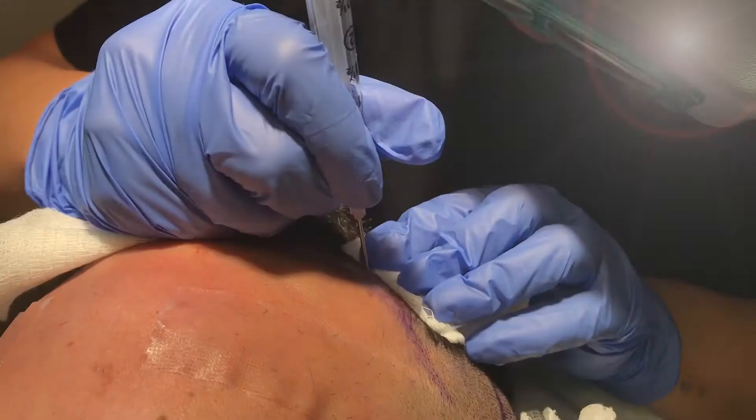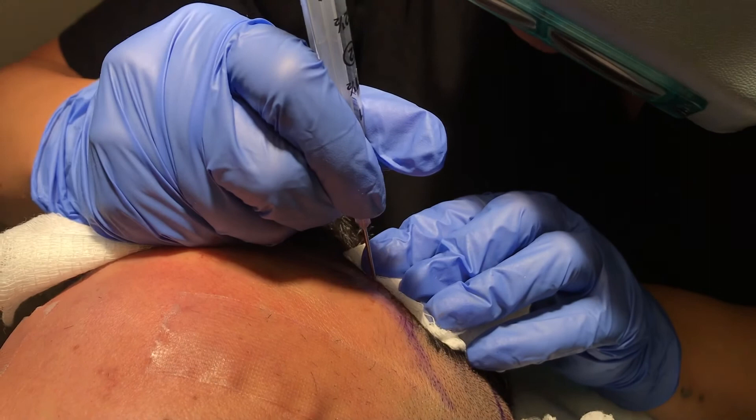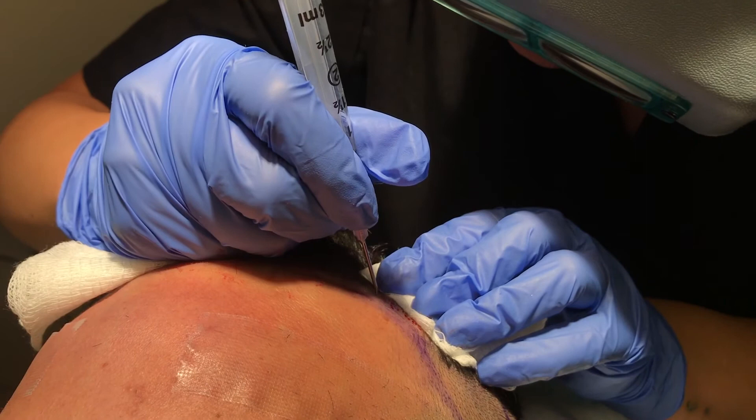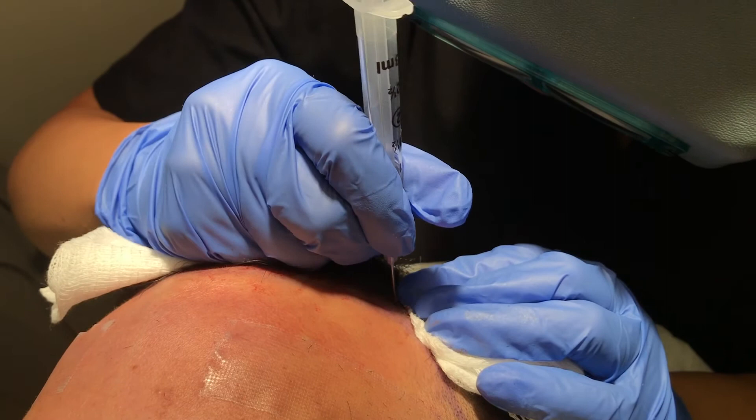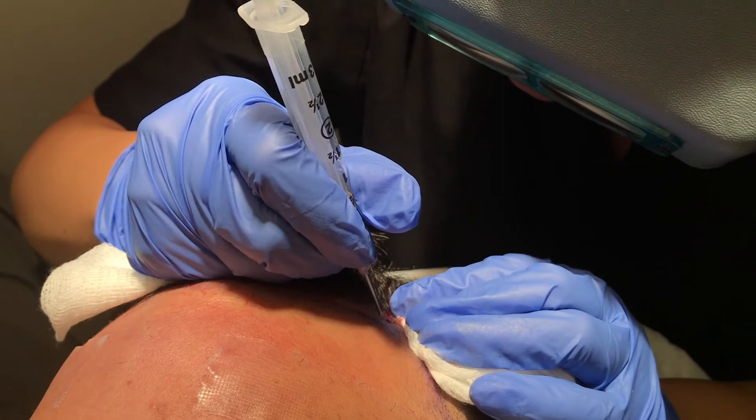Now that the hair is harvested, we're going to the recipient site, which is the two temple areas of the forehead. Here we make little pinhole sites angled specifically to mimic the natural angle of the hair growing in that region. Each hair is then individually placed as if planting a seed into each hole, allowing the hair not only to grow but to grow back at the same angle for a very natural hairline.